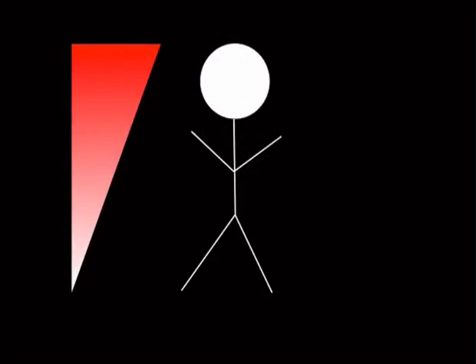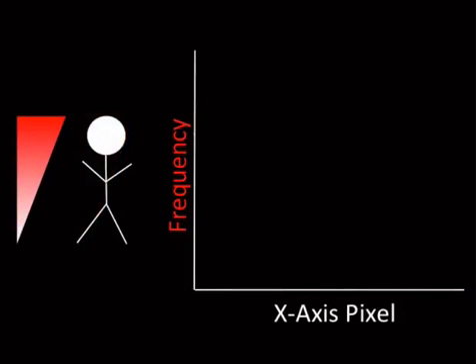So you may remember that a gradient is used for localizing a particular voxel or a point in space, so there's a phase encoding direction and a frequency encoding direction. We're going to talk about this frequency encoding direction first. So a gradient is applied so you can tell things are in different locations.